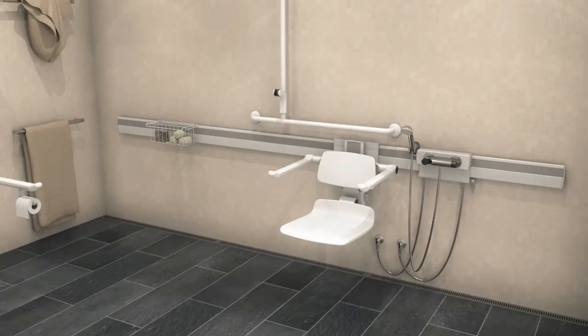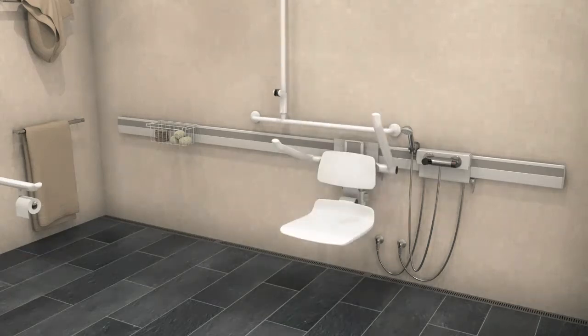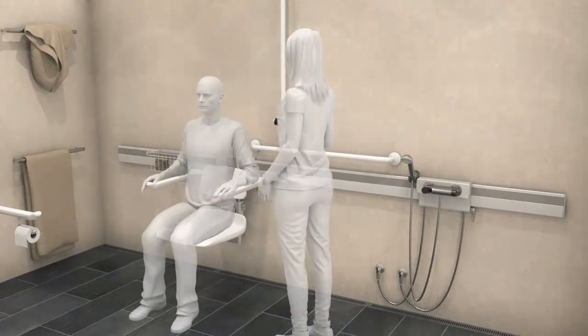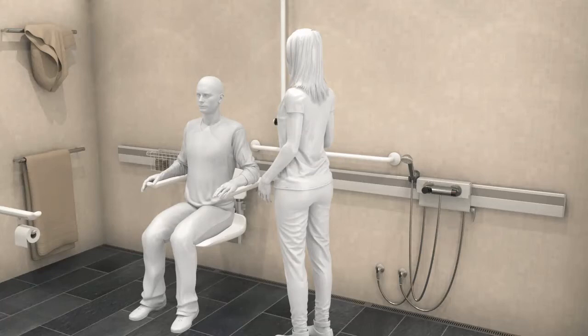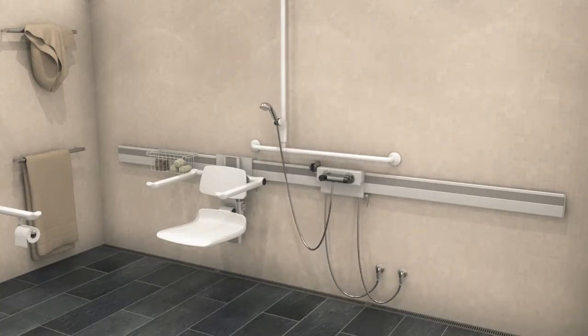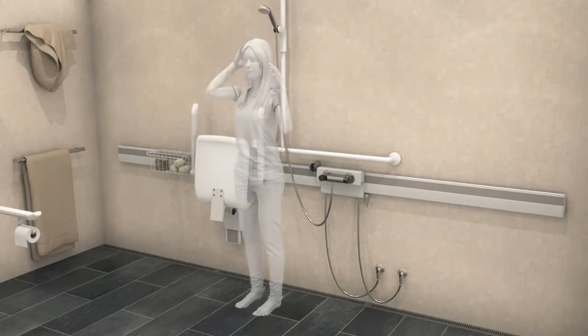The height of the armrests adjusts independently of the seat and backrest. The seat and armrests fold up against the wall after use to free up space in the room. A horizontal track on the wall ensures that the shower seat can be moved in and out of the shower area and placed so as to provide ample space for a helper. A one-hand operated holder for the shower head makes it possible to slide and secure it on the handrail.